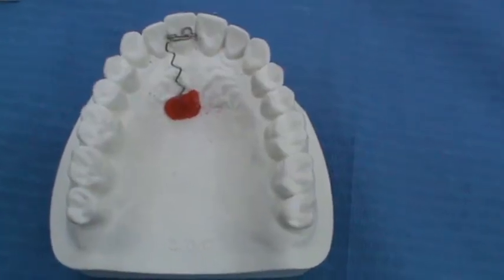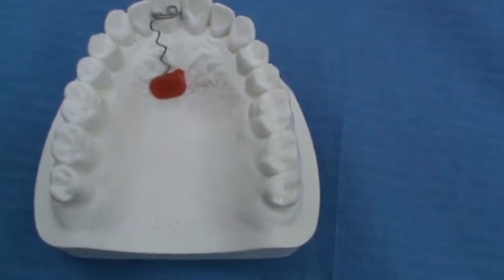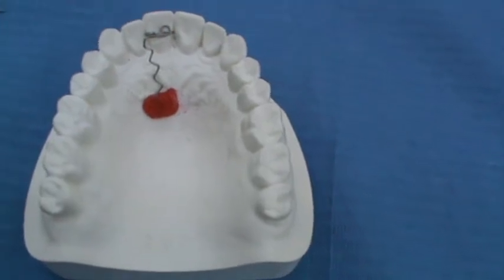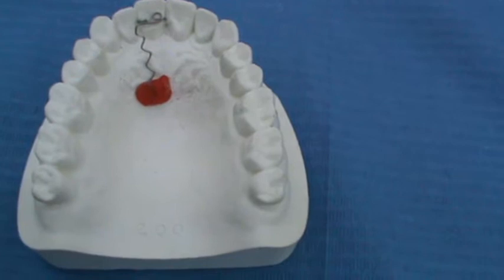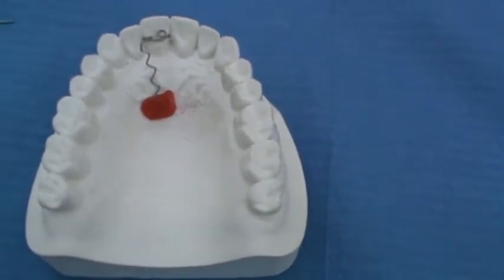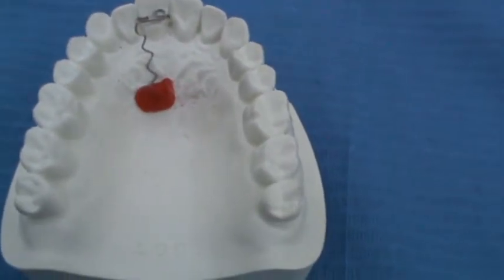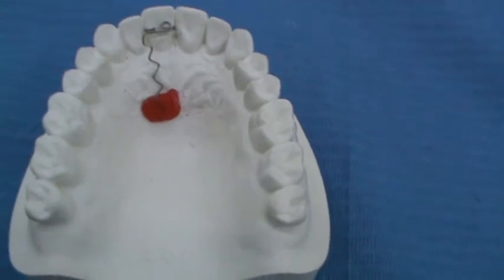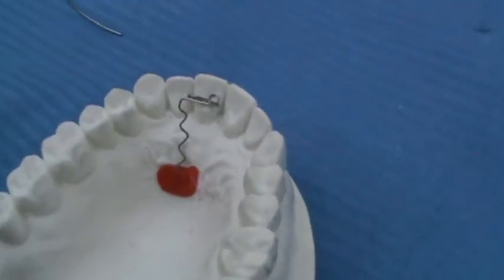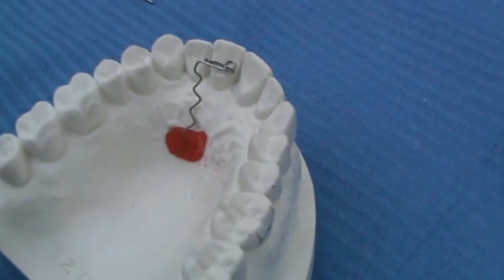This is a demonstration of the Z-Spring, also called the double cantilever spring, which is an active component of the removable orthodontic appliance, palatally situated. It is used to push one anterior tooth from the lingual or palatal side to the labial direction. Its main uses are the correction of anterior crossbite of one tooth, proclination of an in-standing incisor, and correction of rotation of one incisor less than 90 degrees together with a Howley arch by the couple force system.